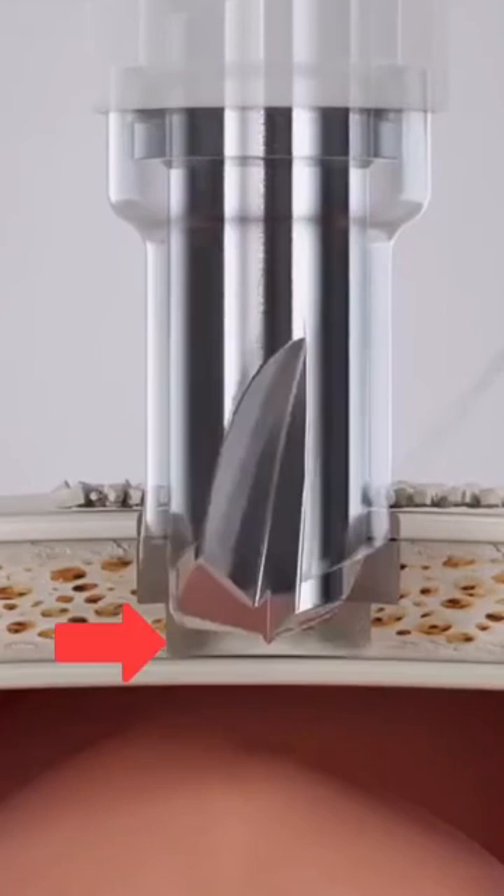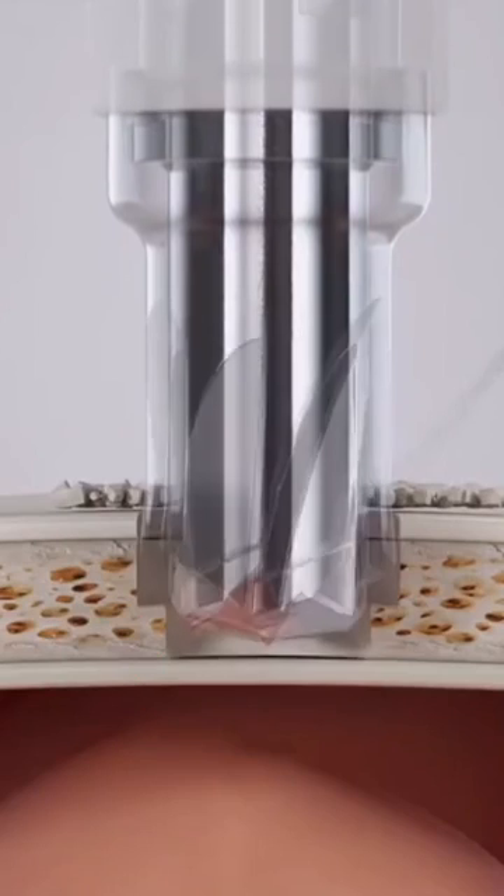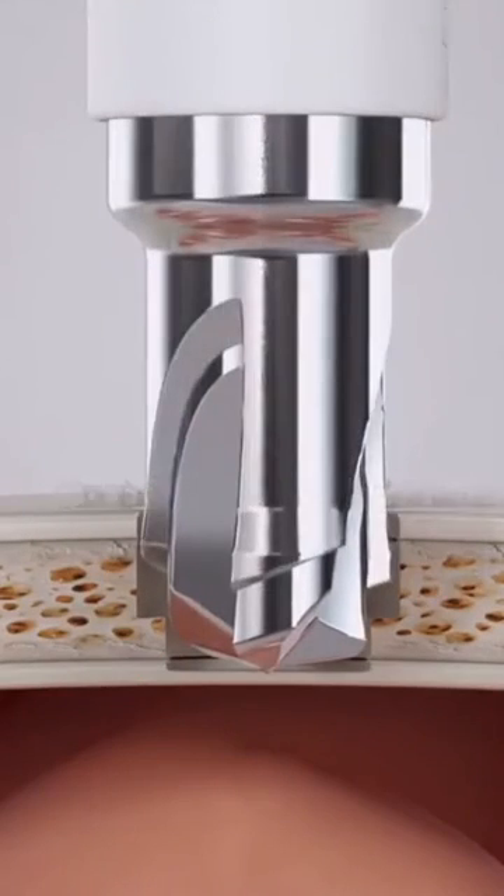Did you notice how it moved down? It's a subtle movement, so let's watch it one more time. As soon as the inner portion depresses like that, it automatically stops.